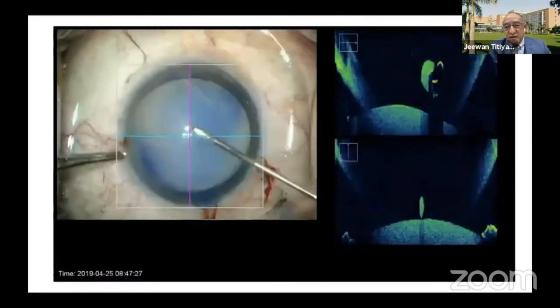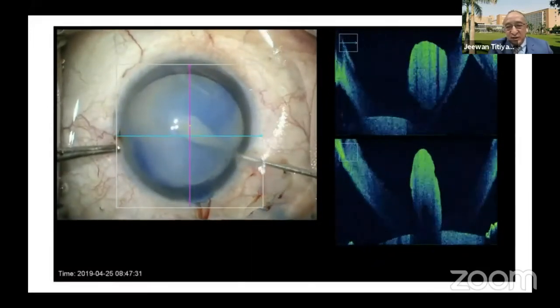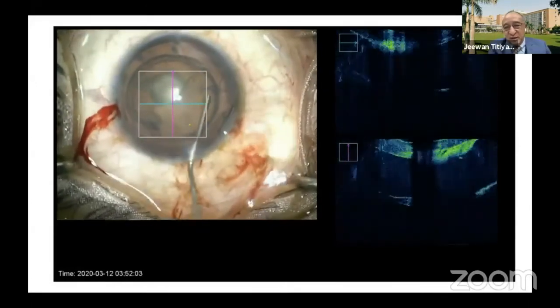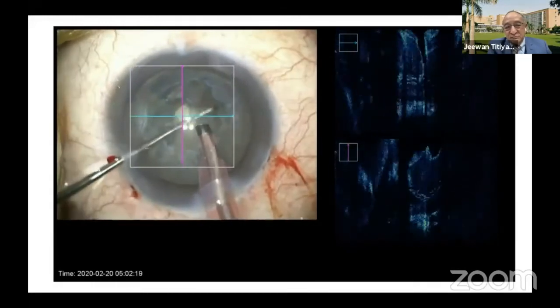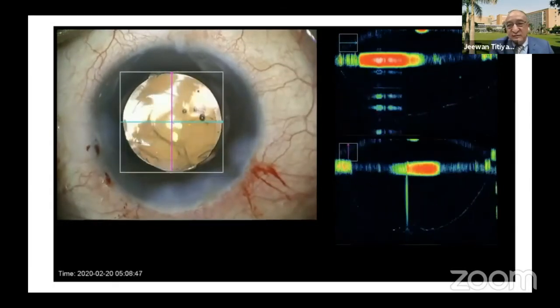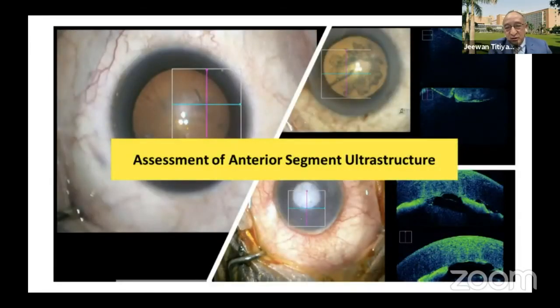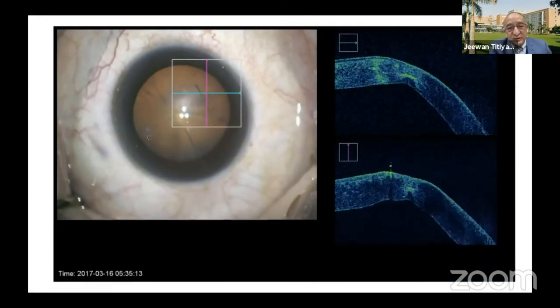Like you see here, it can give you the incision. It can give you the dynamicity after you puncture the capsule. It can give you the assessment of depth of delineation and hydrodissection also. It can also help you in nucleus emulsification by knowing the depth of your initial trench. It can also give you assessment. So this is what anterior segment assessment can be done on the table.